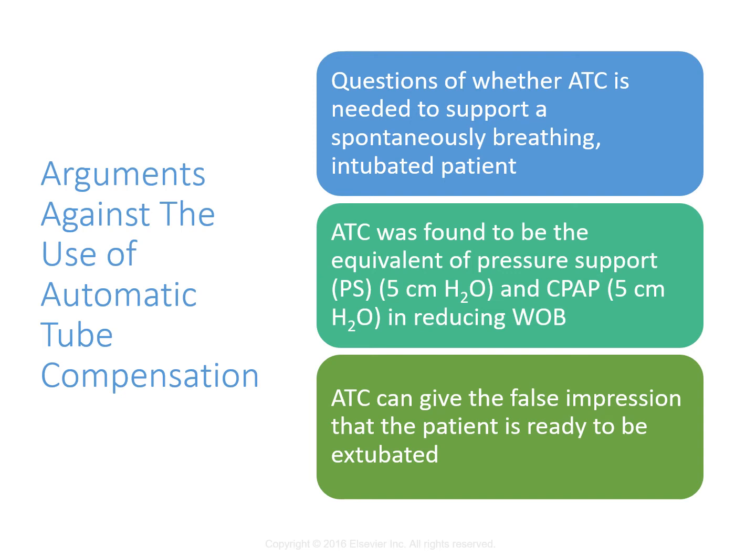A high minute ventilation is not very often seen in an intubated patient breathing spontaneously, right? So if they're breathing spontaneously and they need a minute ventilation over 10, then unless they're a really, really tall person, that person probably needs to be in an assisted mode, right?